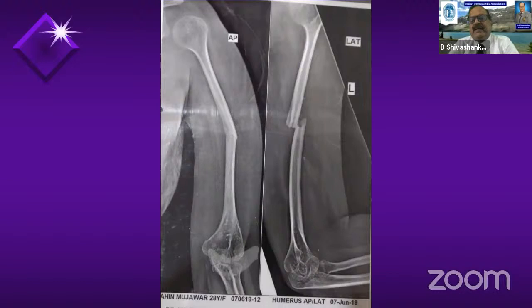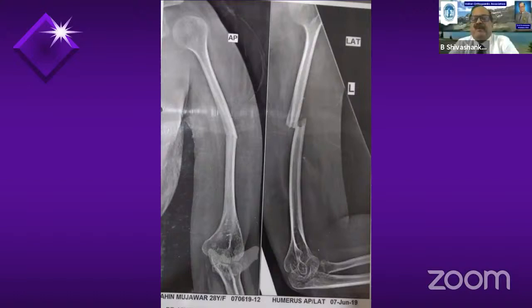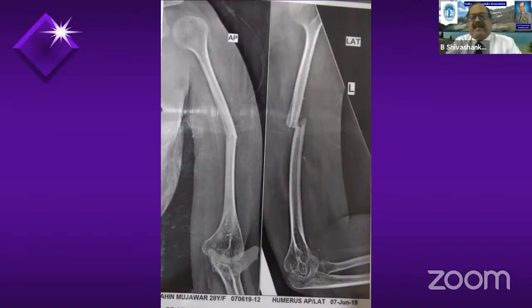Yes, Sergio, any take on this? No, I would do it exactly, but I put the 2 last screws. But I would do exactly the same. What calls my attention is that it seems to be some pathological bone, and now I understand. Polio. Shiva, one question, please. There is muscle activity or not? Not much activity in the shoulder and the elbow. It's only in the wrist.